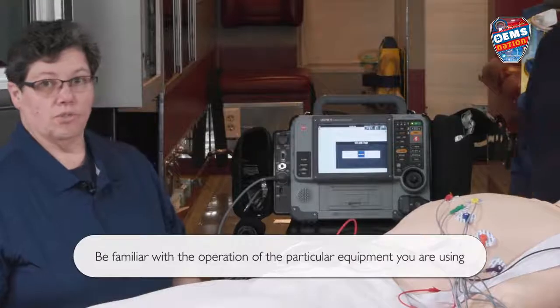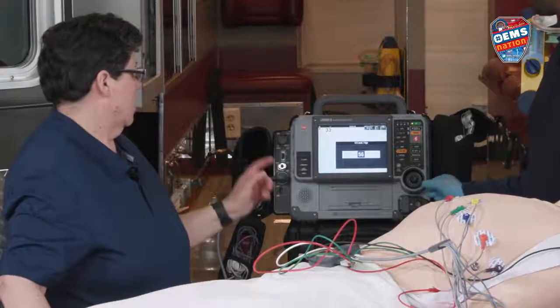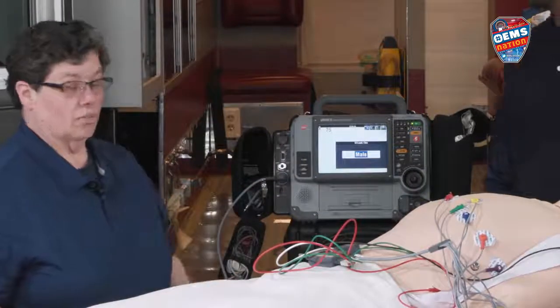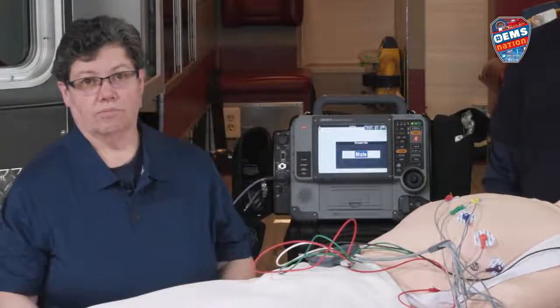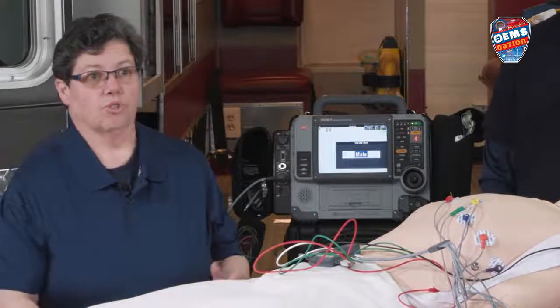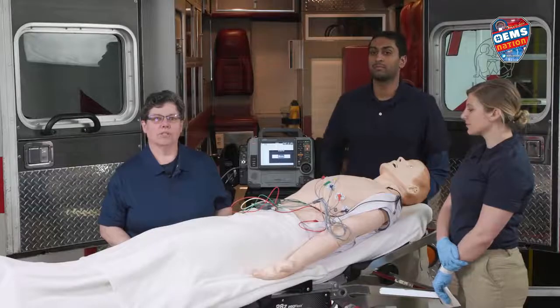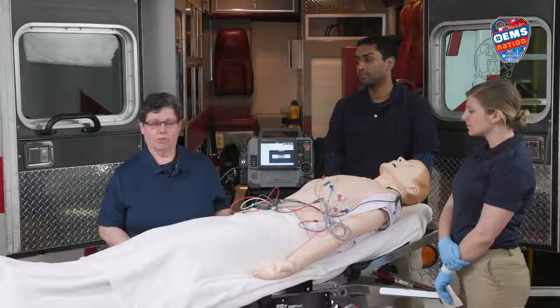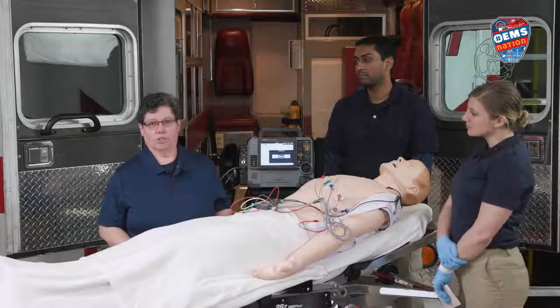The monitor is going to ask you to enter the patient's age — select that. It also asks for the patient's sex — select that, and it will perform the 12-lead. There are several different steps to transmit it to the hospital depending on the type of monitor you have. It's very important to send your 12-lead EKG to an ED physician so they may interpret it, order any interventions they want you to do, and advise you on what destination you should bring your patient to.